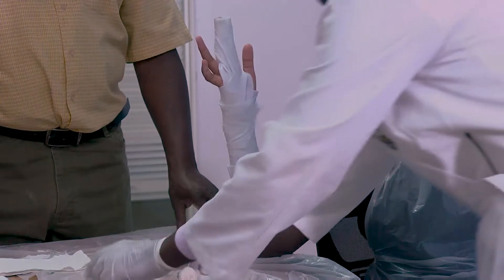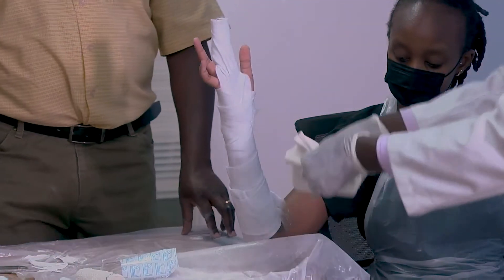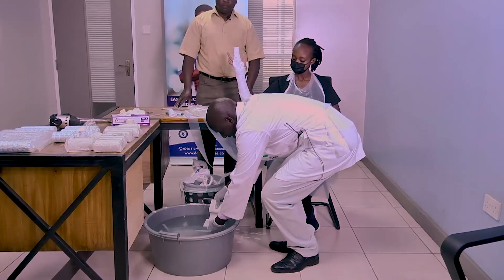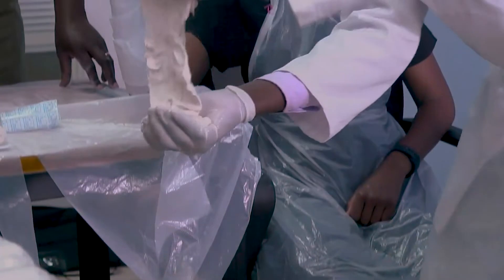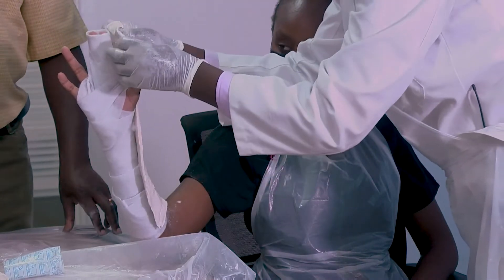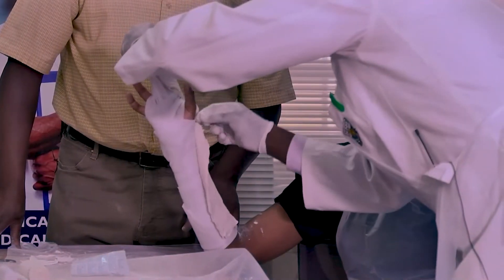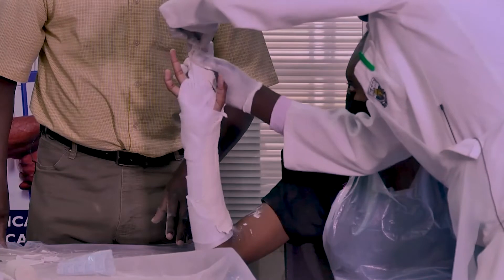We are now ready to apply our radial gutter splint. This is our slab — you need to be able to fold it. It's important to know how to hold and how to position it. We want to dip it into the water — dip it vertically at 45 degrees. I like counting to 3, 4, 5, then squeeze it. Don't remove too much water; don't squeeze it too much because you need it for molding. Then bring your slab passing through the radial bone. The radial gutter splint is passing through the second and third metacarpal, and you can see the space for the thumb.